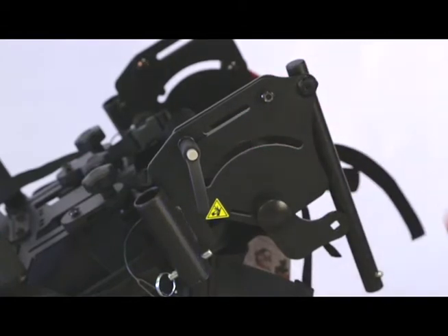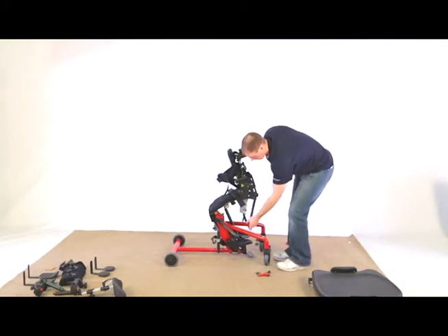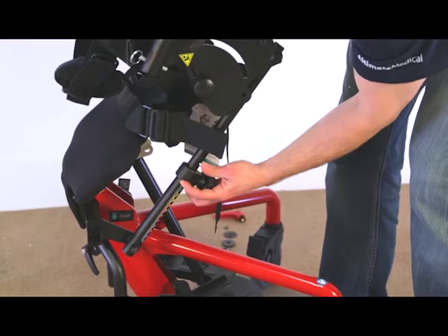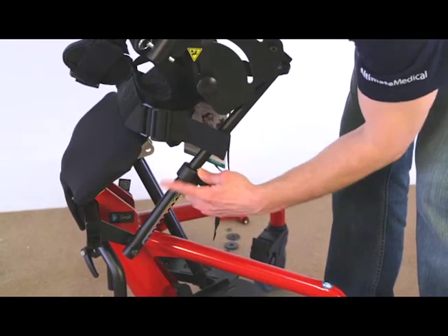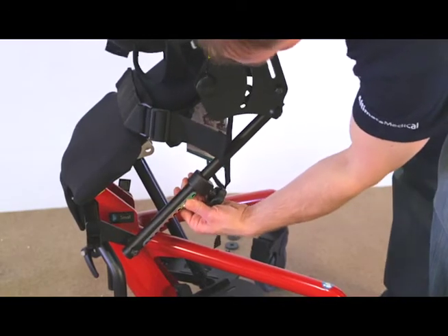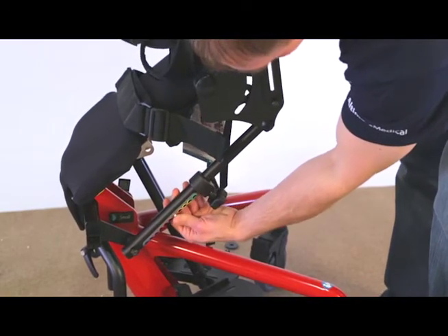If the supine option was ordered, remove the red locking handles, bolts, and washers on both sides and set aside. Line up the following arm with the back angle tube. Depress the spring button to allow the following arm to slide into place. Match the following arm position color with the corresponding seat depth color.